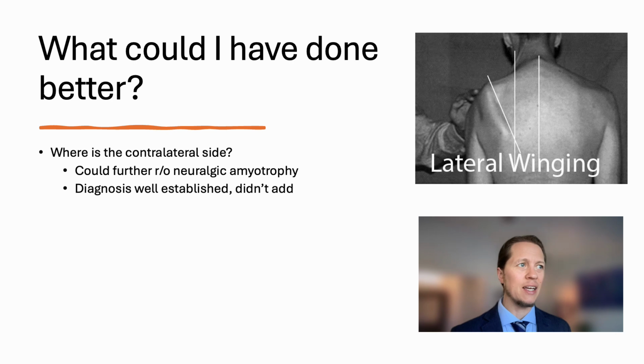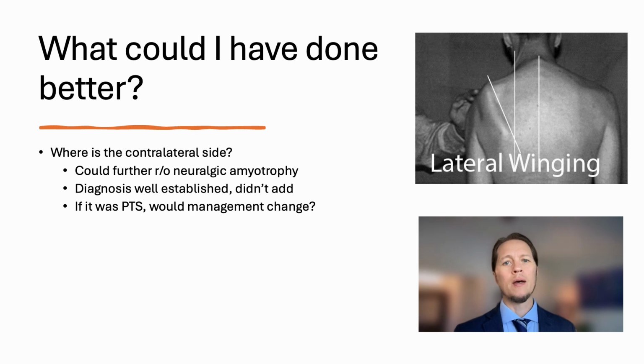But in this case, I don't think it really added. The diagnosis was pretty darn clear. It was just one muscle involved on nerve conduction, on EMG, and on ultrasound. I think it was a slam dunk. But think about this. Let's say it was Parsonage-Turner. Would it really change? This patient presented, I think it was like 6 or 8 months after the initial problem.